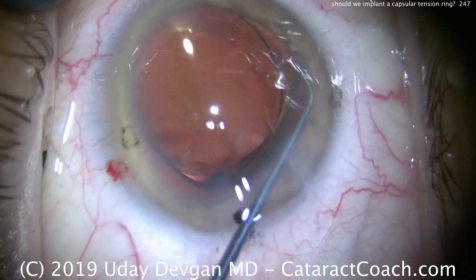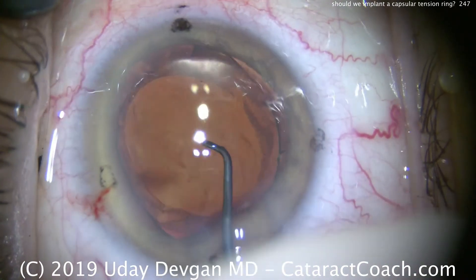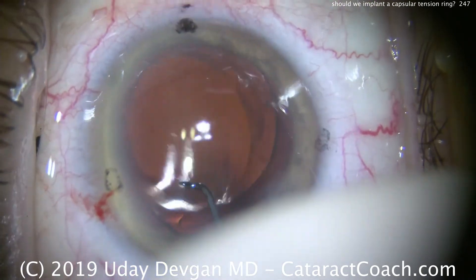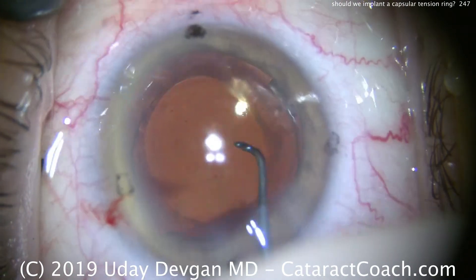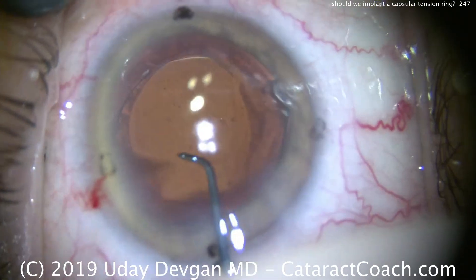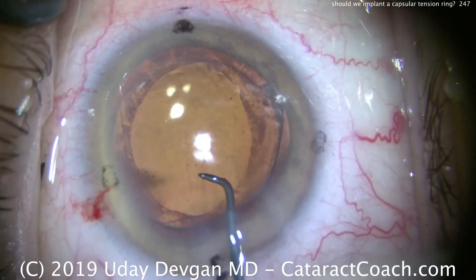So nice and easy — get the lens completely in the capsular bag. Let's rotate the lens to the appropriate position. We get the lens rotated clockwise to where we want it. Now look at the rhexis — even having viscoelastic in the eye, it's a little bit oval-shaped now. It's not quite as round as it was before. This is, of course, due to the outward force of the haptics and the presence of the looser zonules.